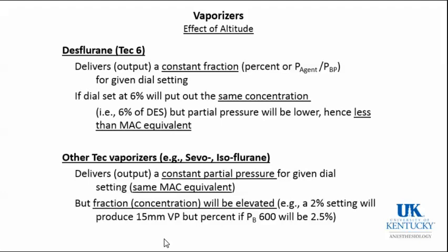Finally, at least in the past, questions about altitude have been raised, and I discuss that here. The Desflurane vaporizer delivers a constant fraction, a percent of the agent.